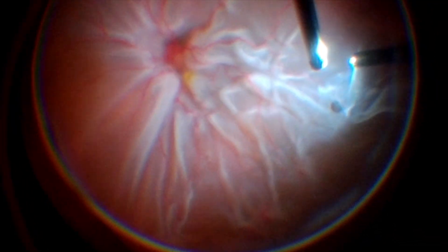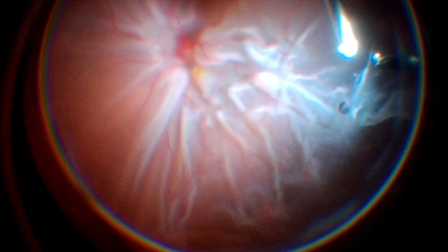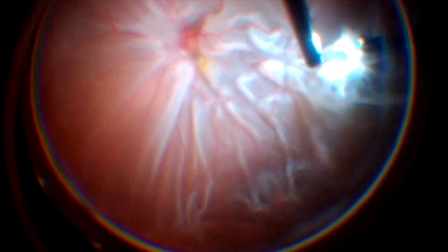We can observe significant vitreoretinal proliferation due to the chronicity of the detachment. Triamcinolone is used to stain the vitreous, and the subretinal fluid is drained through the superior retinal break.